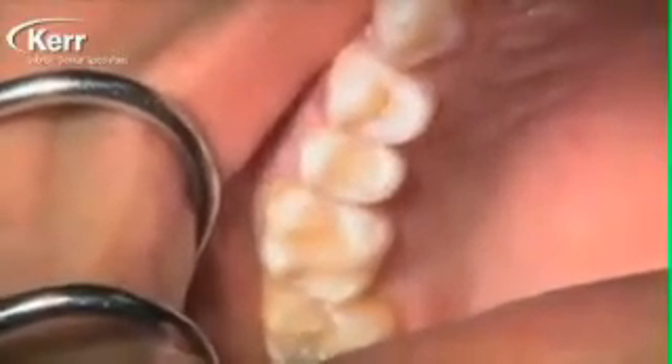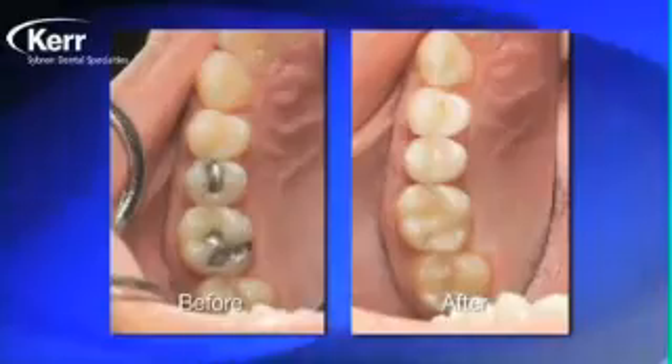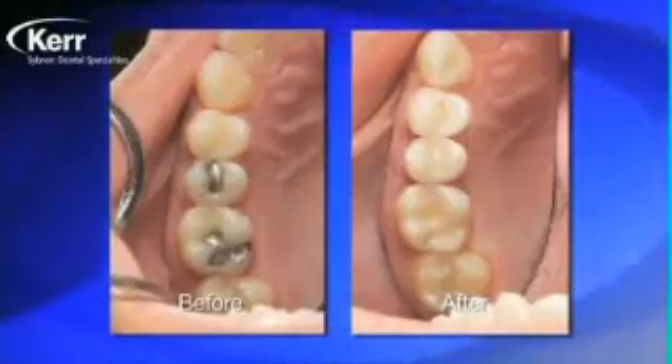We place some more Dyad Flow into the preparation — there's no need to agitate it at this point — cure it for 20 seconds, and then go in and do any finishing or polishing needed. These are the high luster composite points being used on the small restorations. One of the nice things about using the enclosed brush is that you can shape the Dyad Flow with it so when you cure it you shouldn't have too much finishing to do afterwards. You can just see how well the A2 Dyad Flow disappears into the tooth, and look at all the steps we eliminated going from the before to the after.